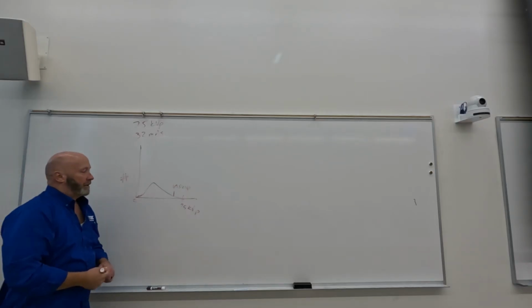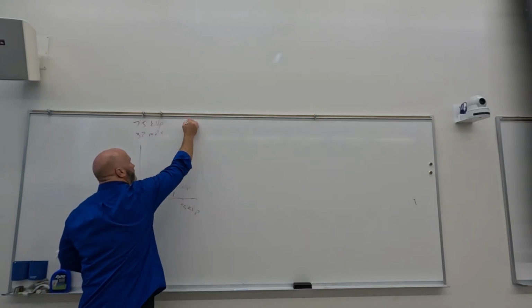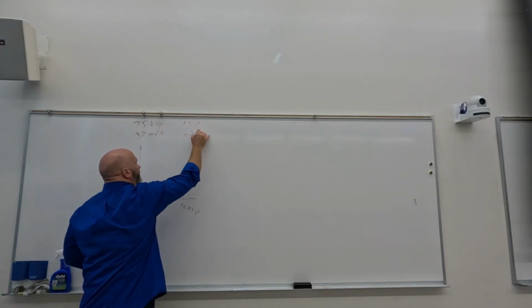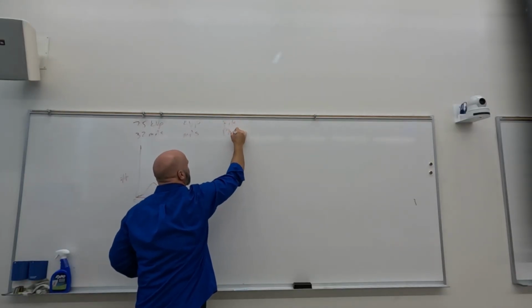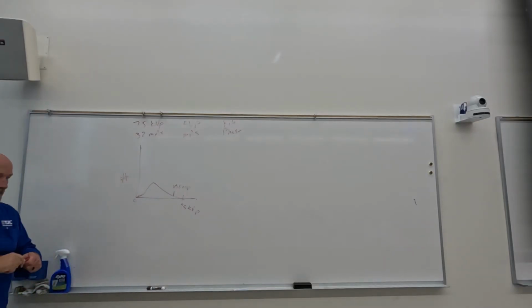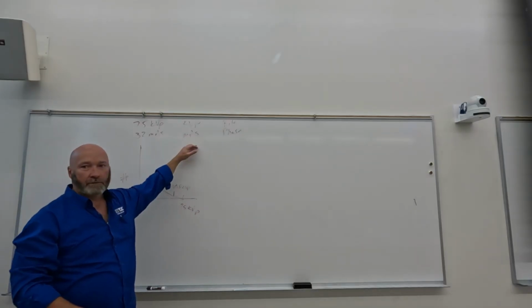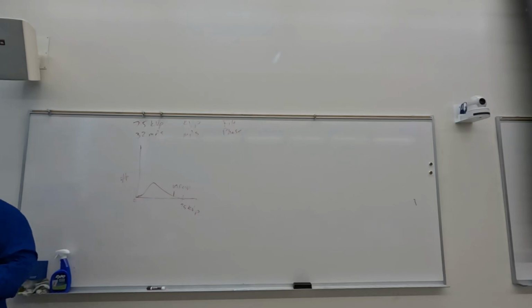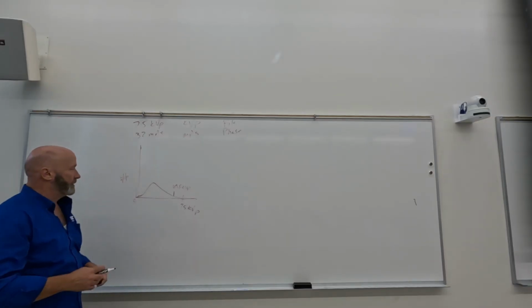Okay. So when we change our factors, again, we're going to focus on kVp, mAs, filtration, and machine phase. All right, so let's start with kVp. When we change kVp, I know that we preach kVp equals quality and mAs equals quantity, right? But if you increase your kVp, that's that one. That's better.